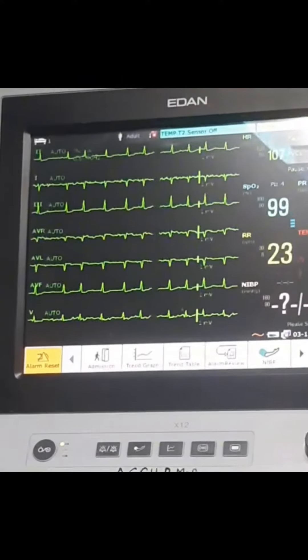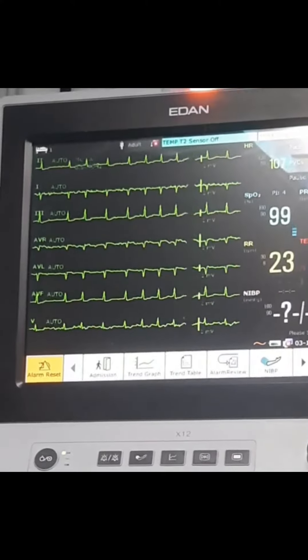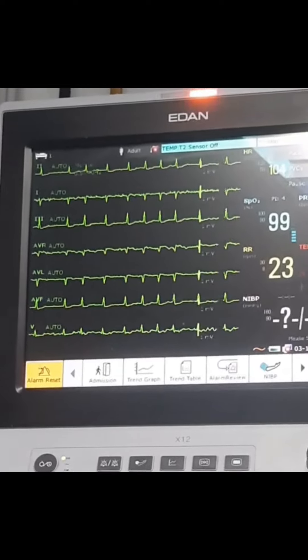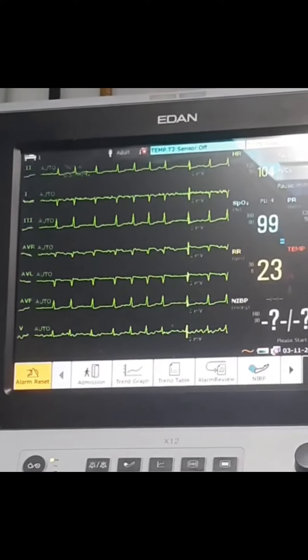Hello, my name is ECTOPATIENT. We are going to do chest pain and palpitations. We are going to do ECG. Let's take a look at the ECG. What is the ECG?